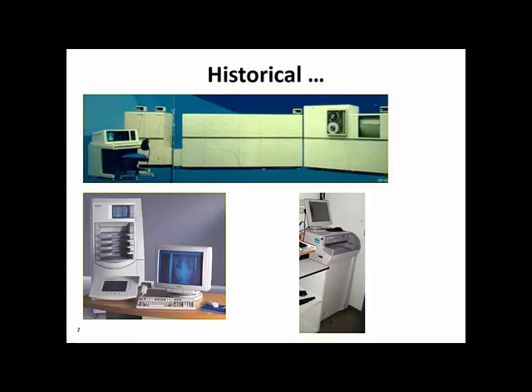Here are some pictures of early systems. This upper picture shows a CR image from Philips from the beginning of the 80s, and some other pictures show how the readers evolved and how they get smaller and better.